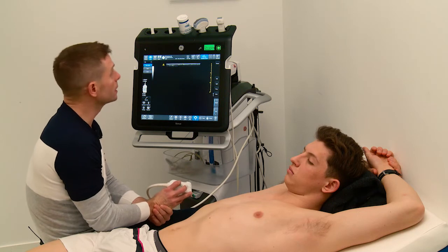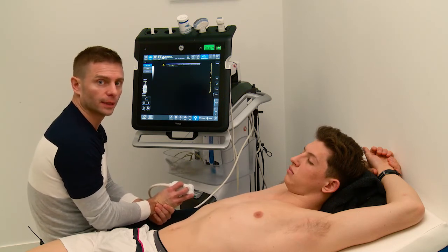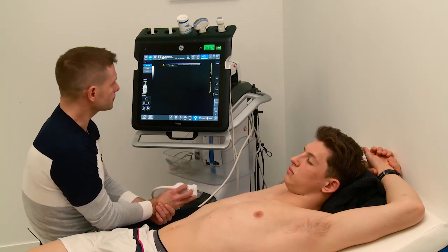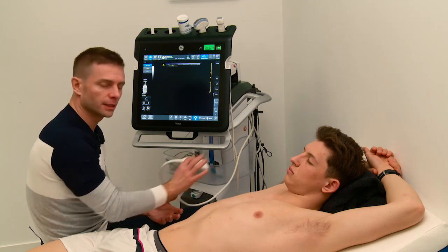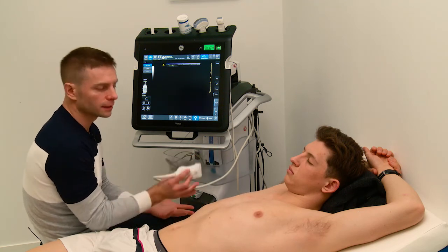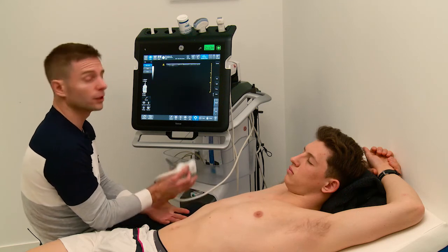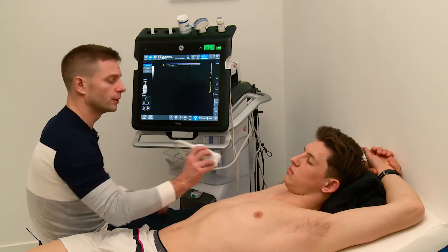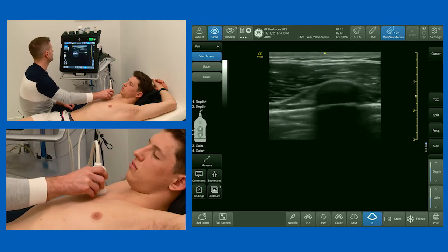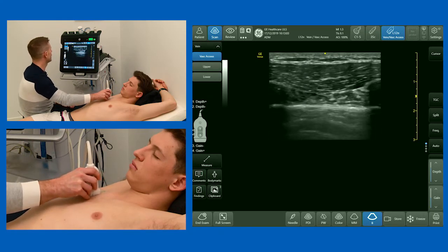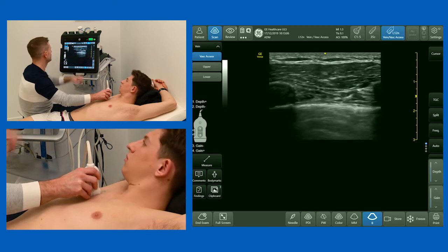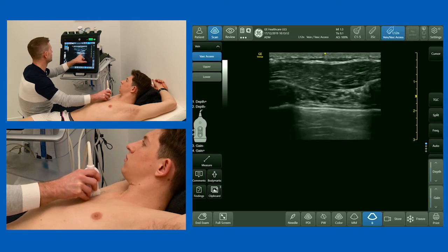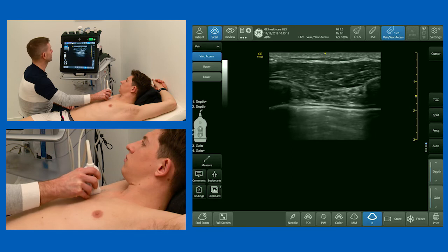I described earlier how we use the curvilinear probe for all of our lung ultrasound examination. Sometimes it can be difficult to work out whether there's lung sliding or not — particularly if a patient is ventilated where the apices don't move as much, when there's lung disease, or when there are low tidal volumes. If you're not sure, you can use the high-frequency linear probe to get better resolution of the pleura. We can put it in the same place and still see the rib shadows and soft tissue, and the pleural line in more detail than with the curvilinear probe.